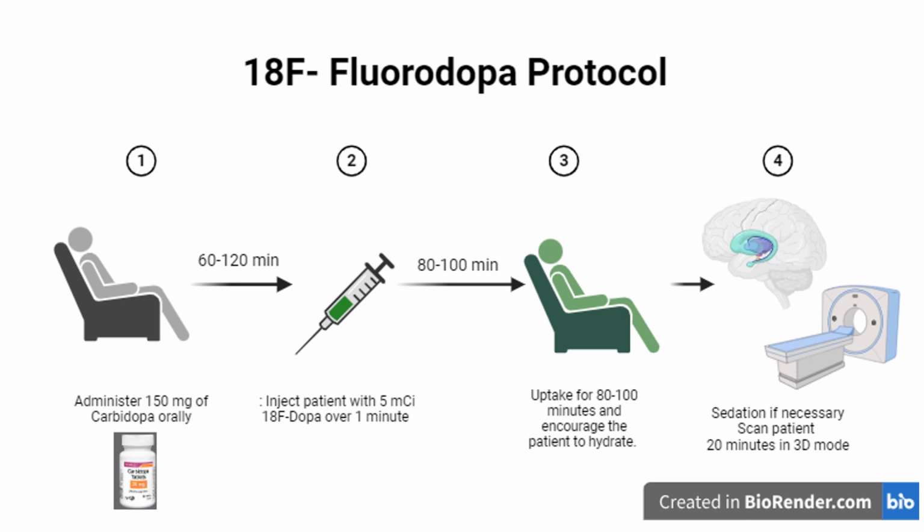They will void before being placed on the scan, and then you can sedate the patient if necessary in order to get that movement to stop. These patients can sometimes be difficult to scan because they do have those abnormal movements and tremors that they can't control.